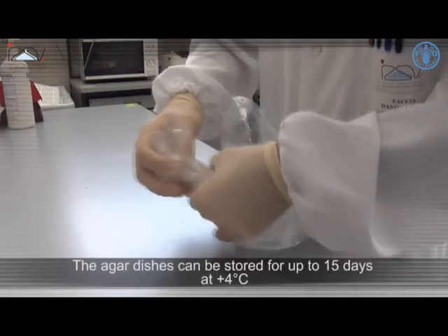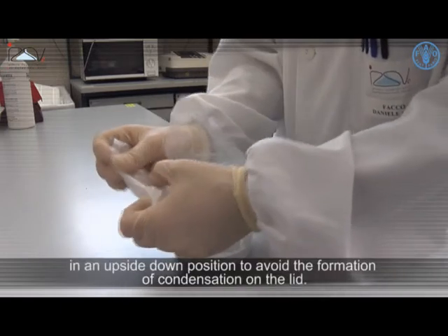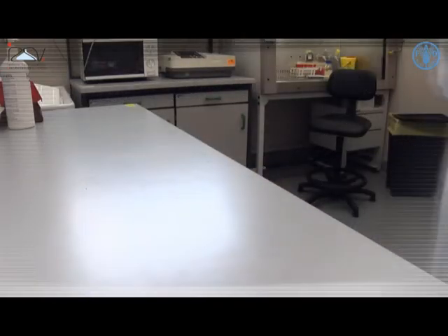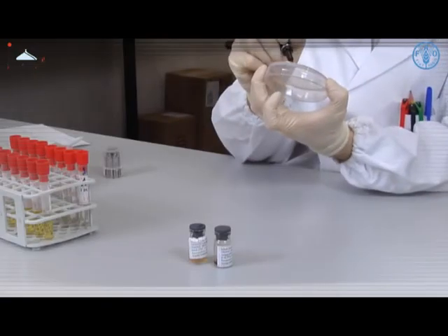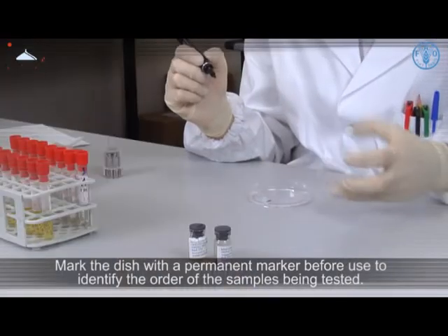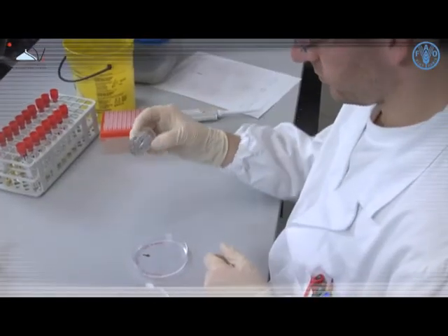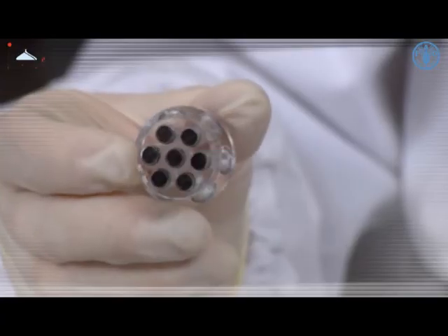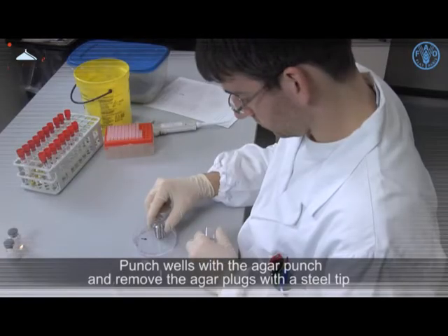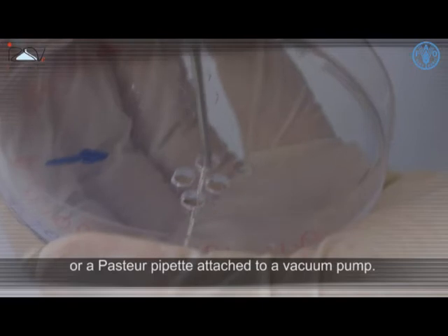The Agar dishes can be stored for up to 15 days at 4 degrees Celsius in an upside-down position to avoid the formation of condensation on the lid. Mark the dish with a permanent marker before use to identify the order of the samples being tested. Punch wells with the Agar punch and remove the Agar plugs with a steel tip or a Pasteur pipette attached to a vacuum pump.